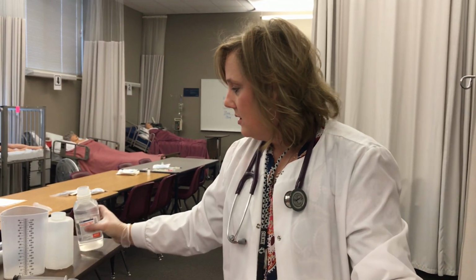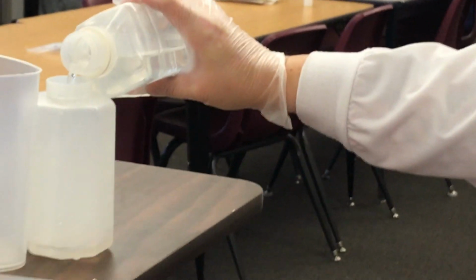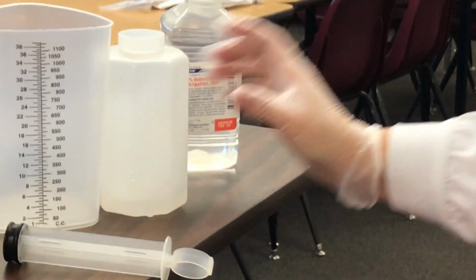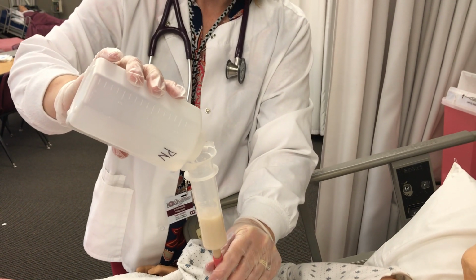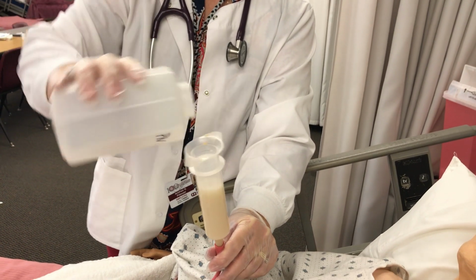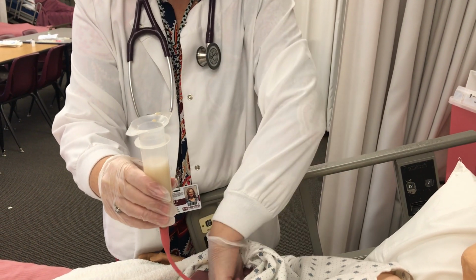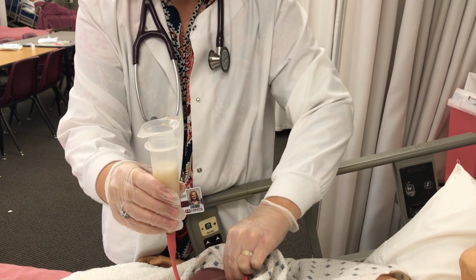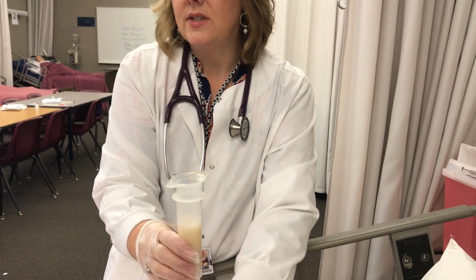So next, the doctor says to flush with 50 cc's after the feeding. So now we'll flush the rest. Okay, and that's going kind of slow as well.